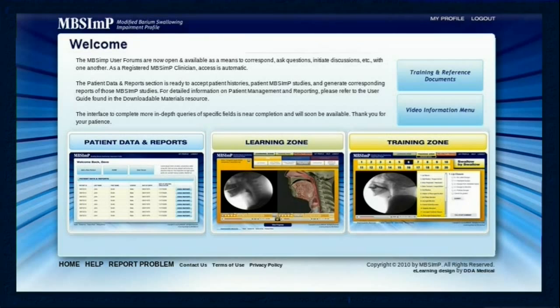To connect with other MBSImP clinicians from around the world via a forum to initiate discussions on the MBSImP and related topics. Compare MBSImP study and treatment results over time. Generate data for performance improvement studies. Track patient progress and outcomes with template query functions.